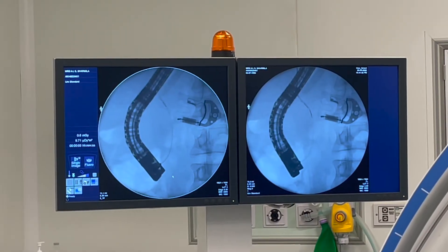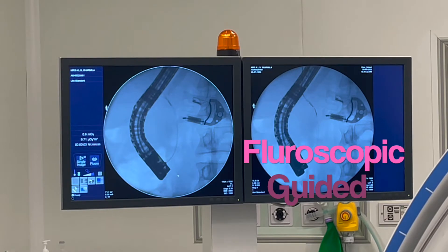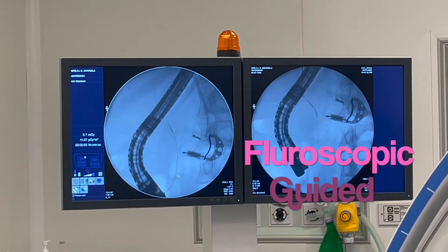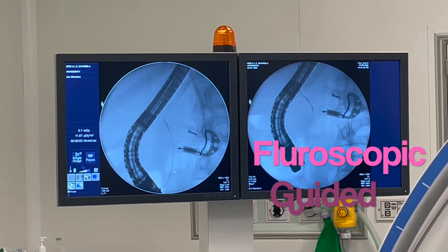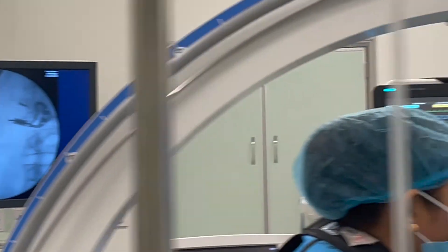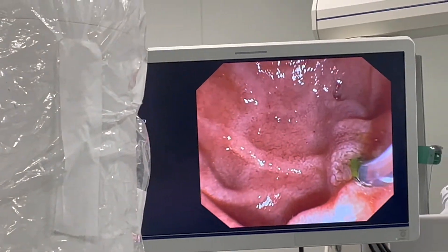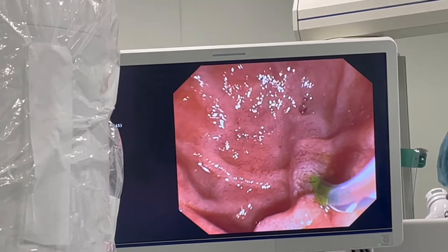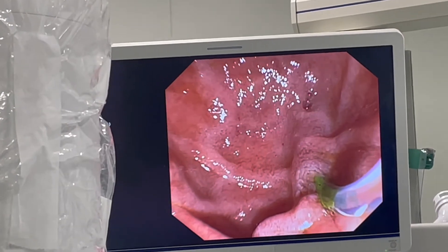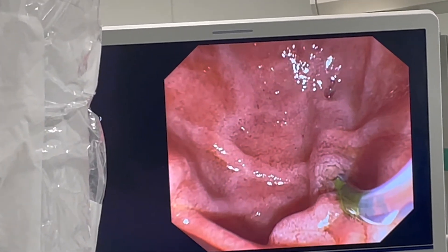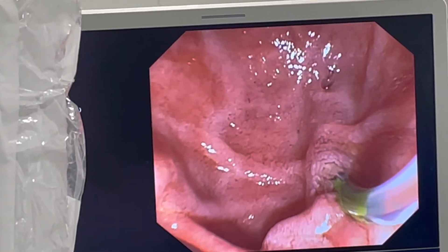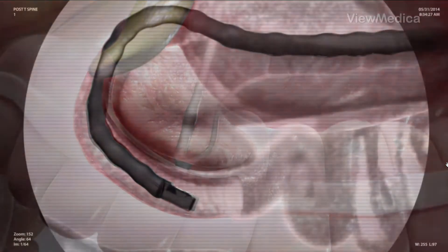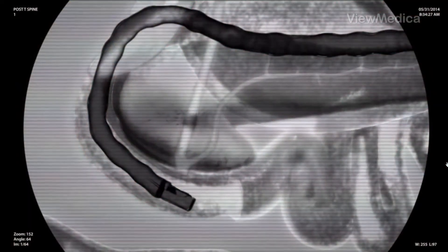A small camera mounted on the endoscope will send a video image to a monitor. The endoscope pumps air into your stomach and duodenum, making them easier to see. During ERCP, the doctor locates the opening where the bile and pancreatic ducts empty into the duodenum, and slides a thin, flexible tube called a catheter through the endoscope and into the ducts.